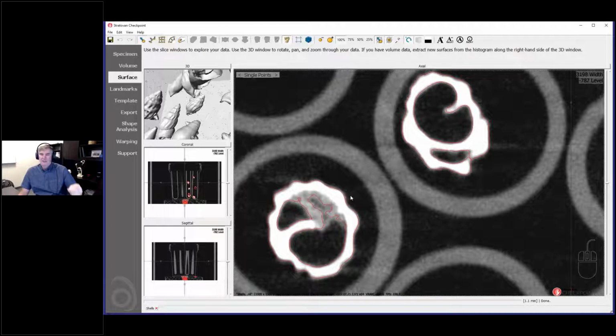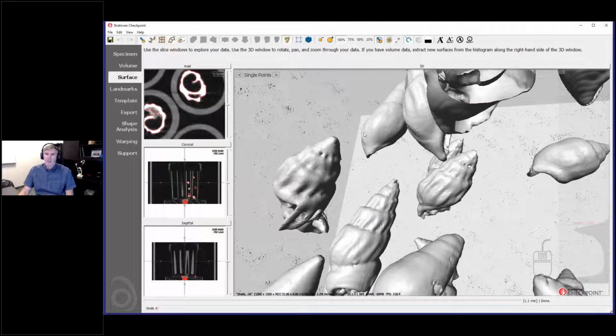An isosurface is effectively the surface in 3D that represents a specific density value. If you think of a contour map, a topography map of height, the contour lines are an iso line at a particular height, and that's what this is represented in 3D. In 3D, instead of a line, you have a surface. That's where we get the triangle surface from here, and this surface represents the exact same density value throughout the volume.